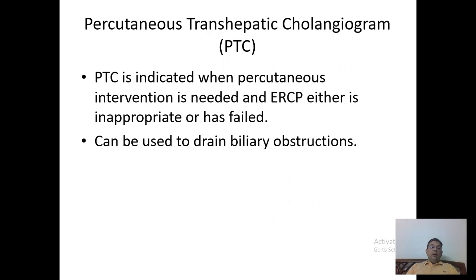Then this was about the gallbladder, but if you want to look at the biliary channels, what are the various modalities available? This one, the percutaneous transhepatic cholangiogram, is done for proximal biliary channels. Proximal जैसे हमने पिछले लेक्चर में एनाटमी में बात की थी कि जो सिस्टिक डक्ट की इंसर्शन से पहले जो है हम उसको प्रॉक्सिमल कहते हैं, और कुछ लोग इसमें सुप्राडूओडिनल पोर्शन को भी ऐड करते हैं. प्रॉक्सिमल बिलरी चैनल्स को देखने के लिए पीटीसी is a good investigation, मगर इसमें it is more invasive.